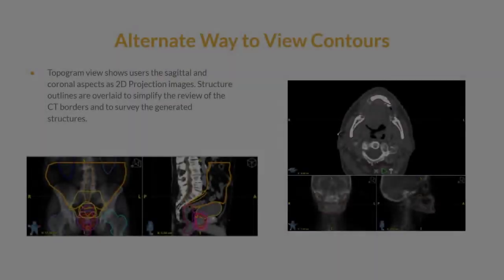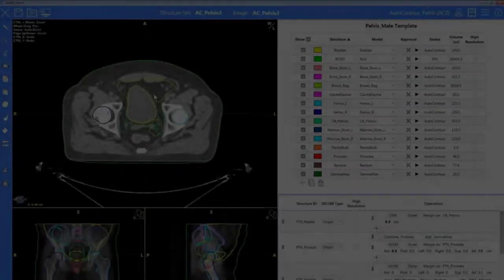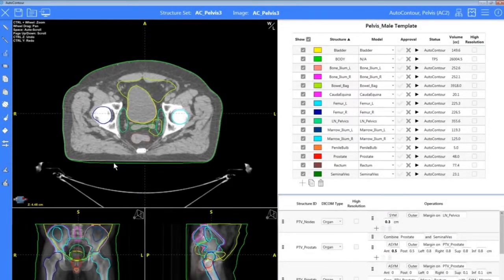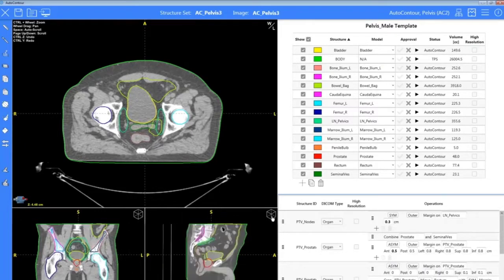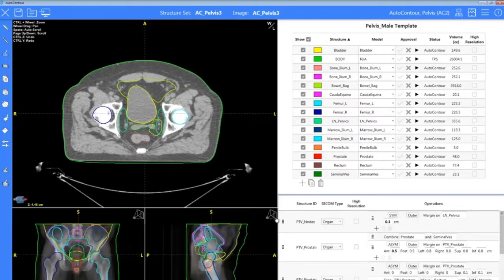Another great new tool is our topogram view, which is an alternate way to view your contours as a 2D projection. This is great for bony anatomy and getting another good glance at those contours. In the axial view, the topogram view appears below, and it can be toggled off if you prefer a traditional coronal view, but I'm going to keep my topogram on today.